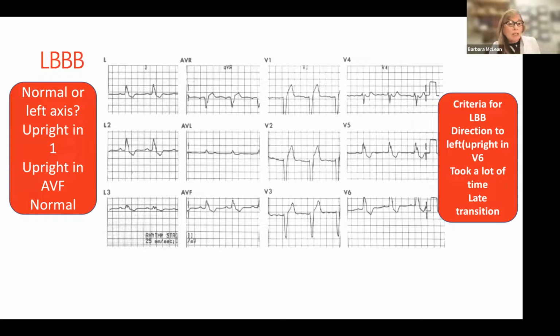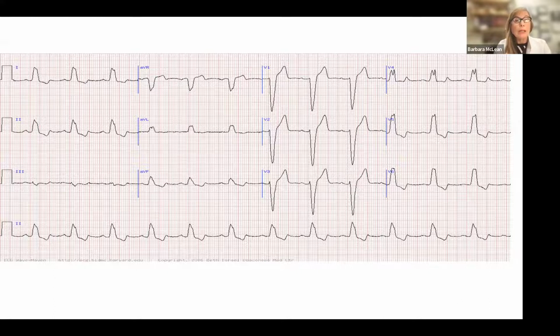I don't ask a cardiologist to do continuous renal replacement therapy. I don't ask a surgeon to do a cardiac cath. Why do I think it's okay for everybody and their brother to take a diagnostically uncertain EKG and activate the cath lab? Don't want to do that. If I am not certain, I'm going to call the cardiologist. Takes a minute for them to look at the EKG, and then they determine whether or not we need to activate.